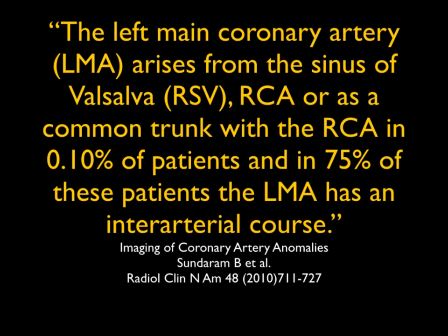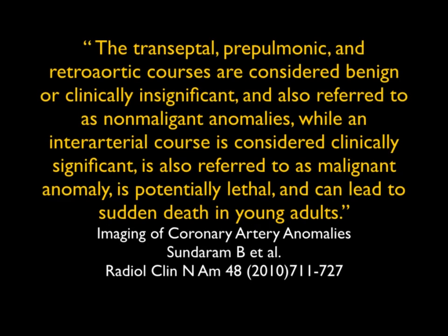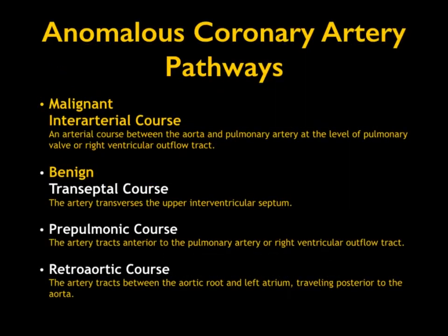This matches very nicely. There are numerous pathways for the left main coronary arising from the right: between the aorta and pulmonary artery as in this case, upper ventricular septum, anterior to the PA, or between the aorta and left atrium — four pathways total. But the one of concern in this case, and typically of concern, is interarterial. The other three are considered clinically insignificant, with interarterial being considered significant — often referred to as a malignant anomaly.